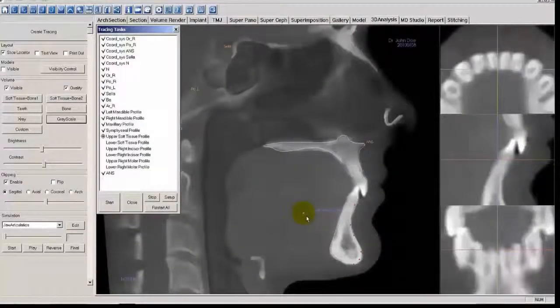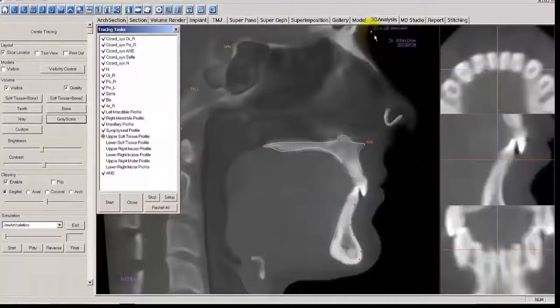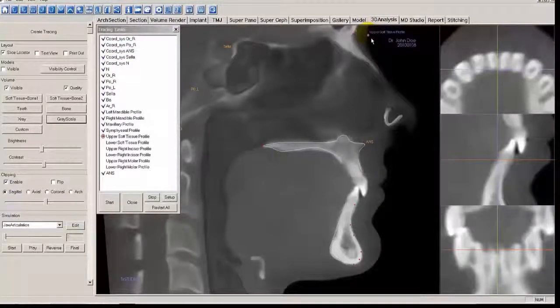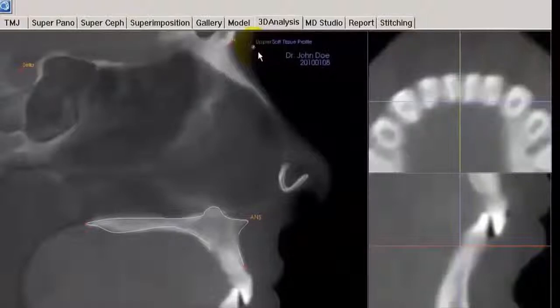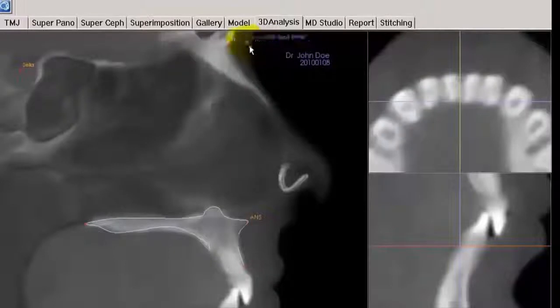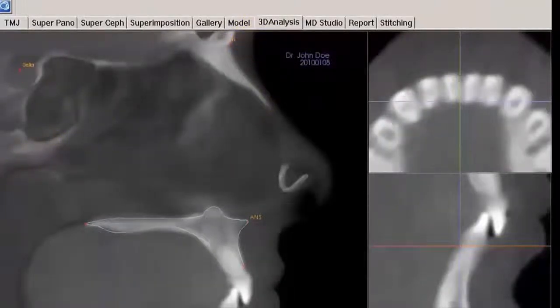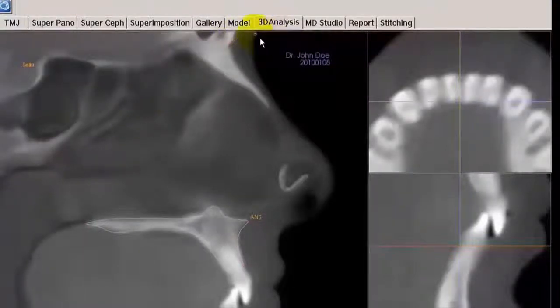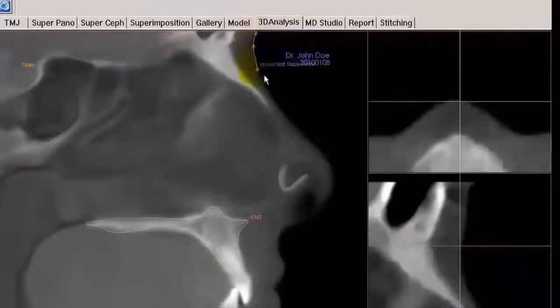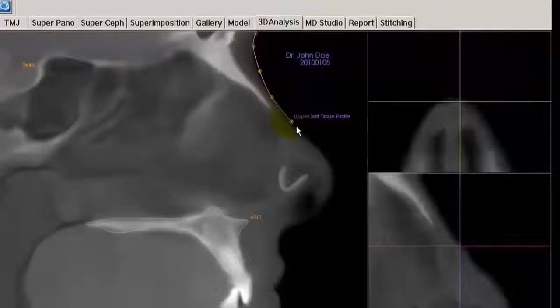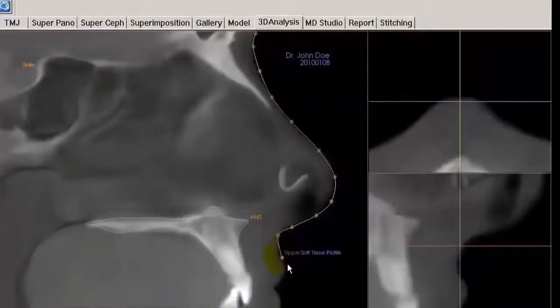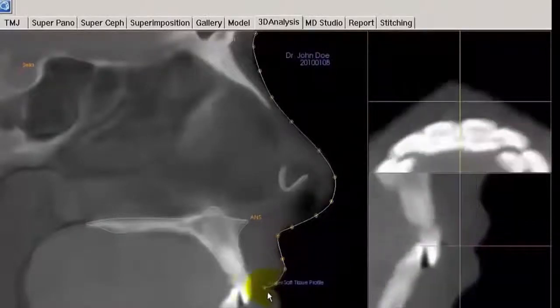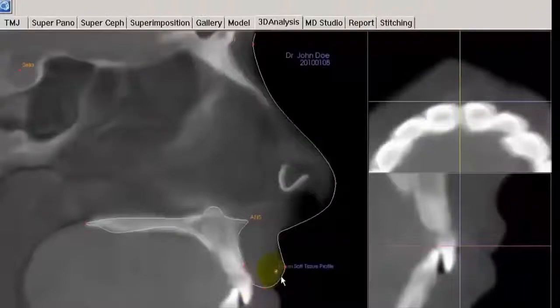Next, we're going to do the Upper Soft Tissue Profile. For a 13-centimeter scan, start at the uppermost part of the scan — usually around the eyebrows. Place points as you follow the outer border of the profile, ending where the upper lip meets with the crown of the upper central incisor. Use brightness and contrast or the scroll wheel to navigate through the lateral slices as needed. Right-mouse click when at the end. Now we're ready for the Lower Soft Tissue Profile — start where the lower lip meets the crown of the upper central incisor and follow the soft tissue profile down, ending past the chin.